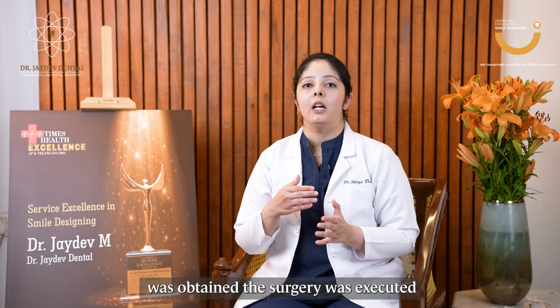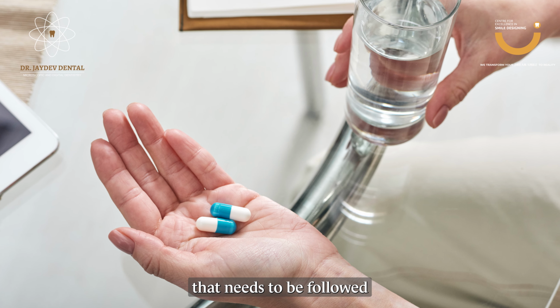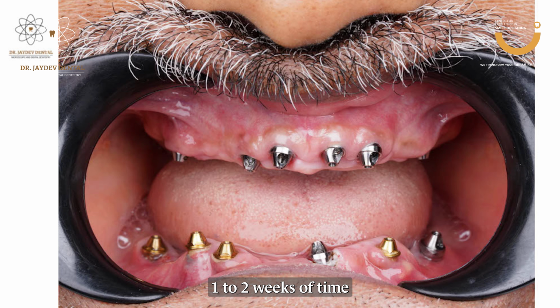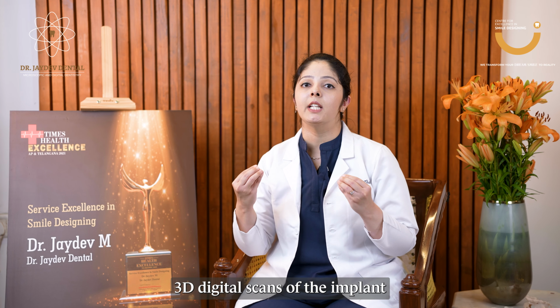Once the clearance from the cardiologist was obtained, the surgery was executed and post-surgical aftercare instructions were imparted to the patient along with the medications that need to be followed. Once the initial healing was achieved, which took around 1 to 2 weeks, the patient was given a provisional or an interim prosthesis. This interim prosthesis was made by recording 3D digital scans of the implants that were precisely placed into his mouth.